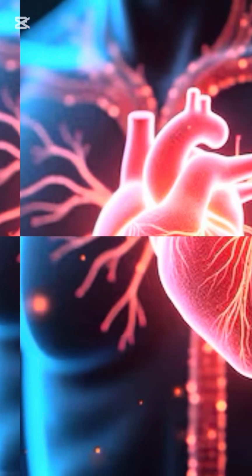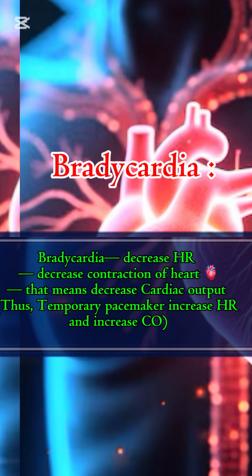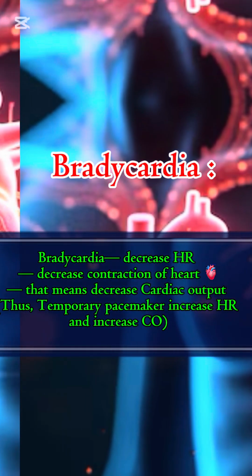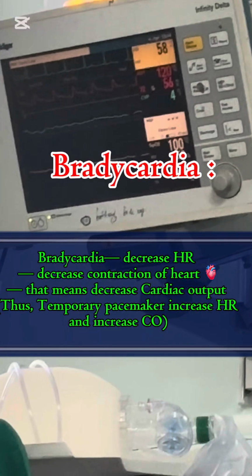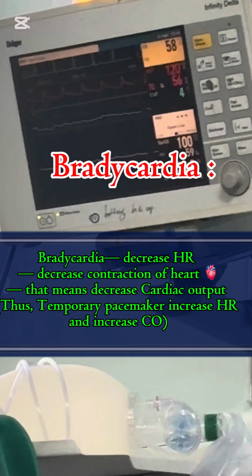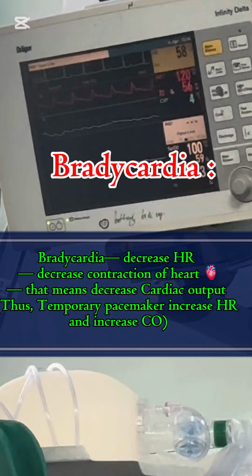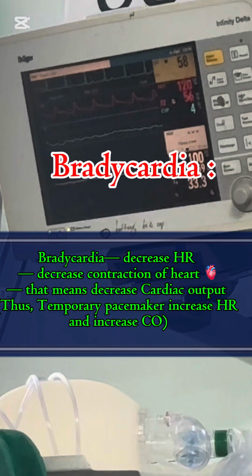As we previously discussed, temporary pacemakers are used in bradycardia. Bradycardia means decreased heart rate. That means decreased contraction, which ultimately results in decreased cardiac output. So, temporary pacemakers are used to increase the heart rate and to increase the cardiac output.